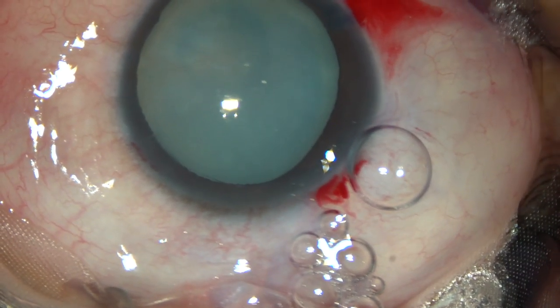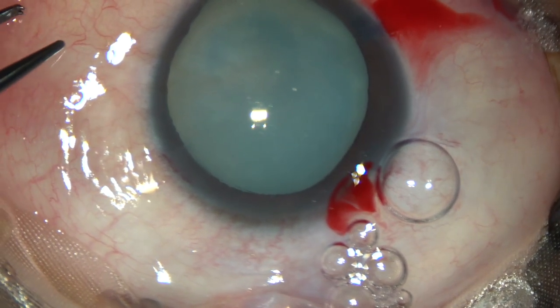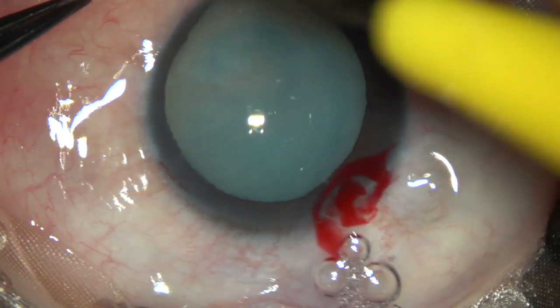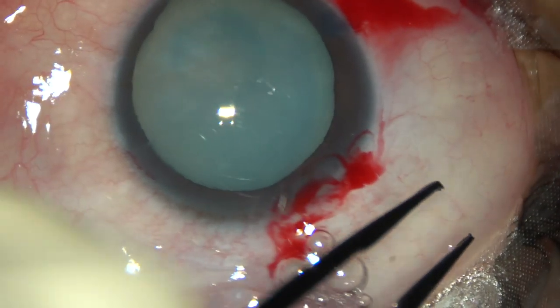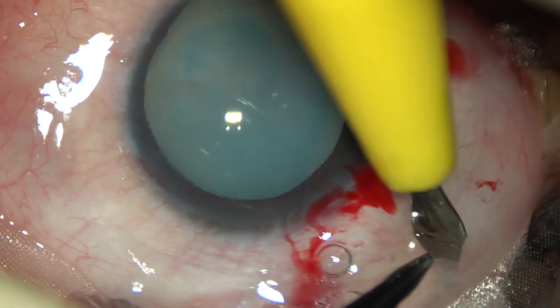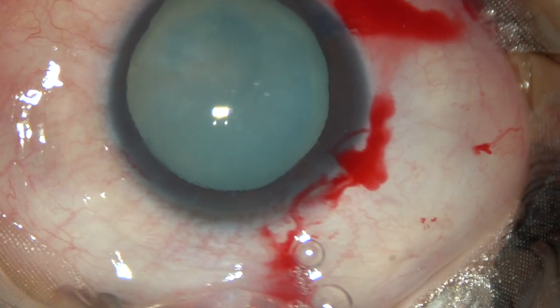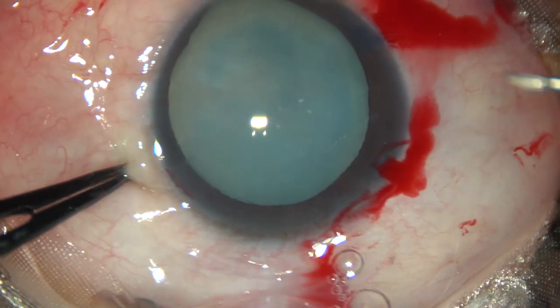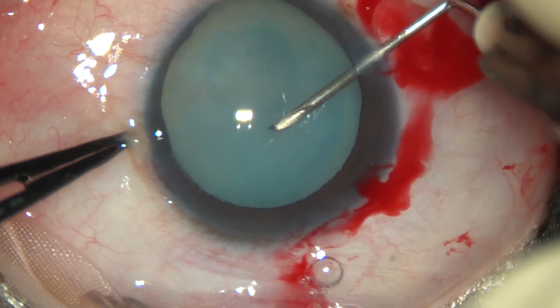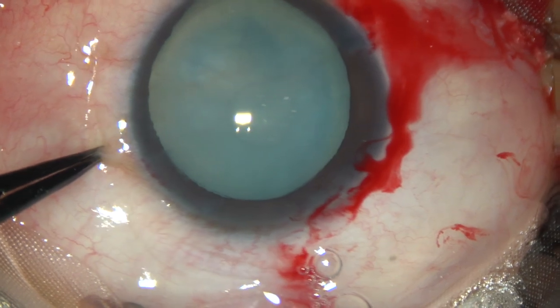Now it's time to do capsulorhexis. I take a 26-gauge bent needle cystotome. Before that, I noticed there is chemosis — the conjunctiva is swollen up. So I made some punctures so that the chemosis gets reduced in a short time. The anterior capsule has been incised and some milky fluid has come out.